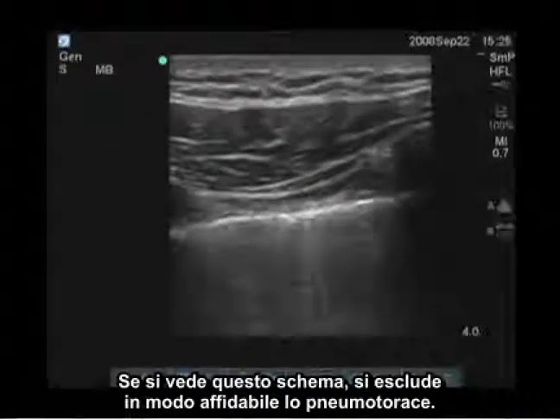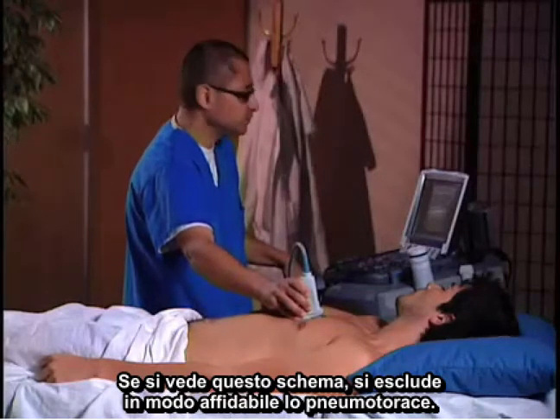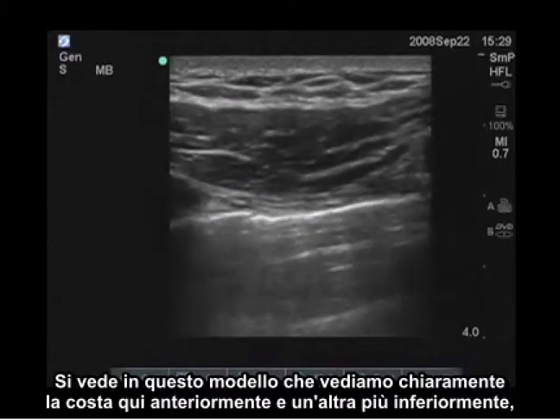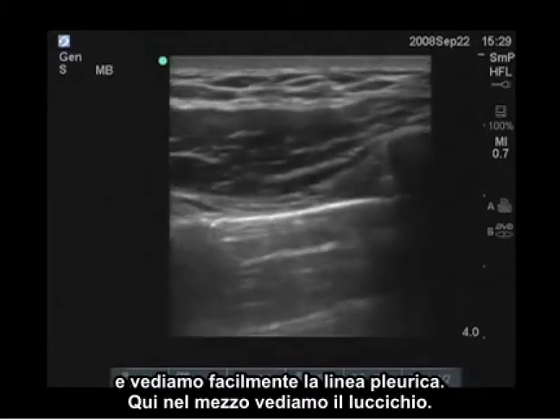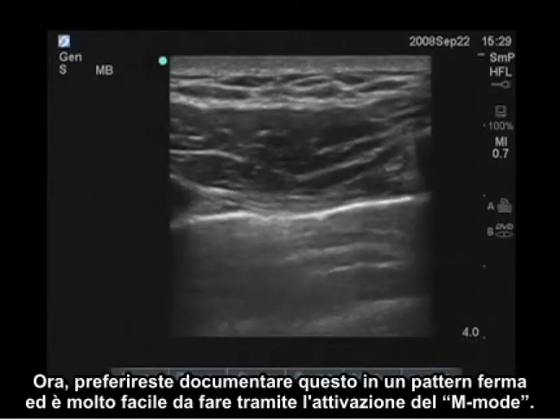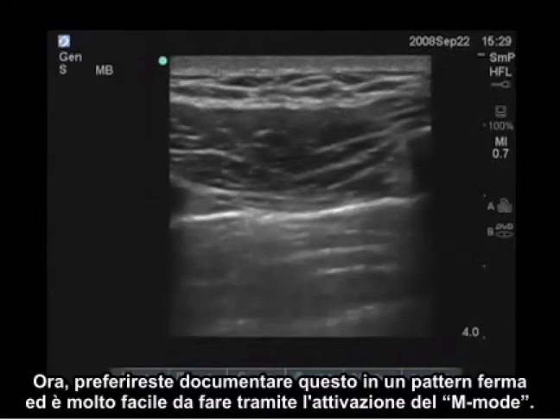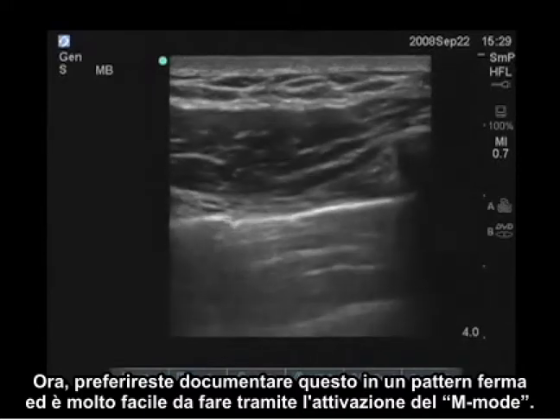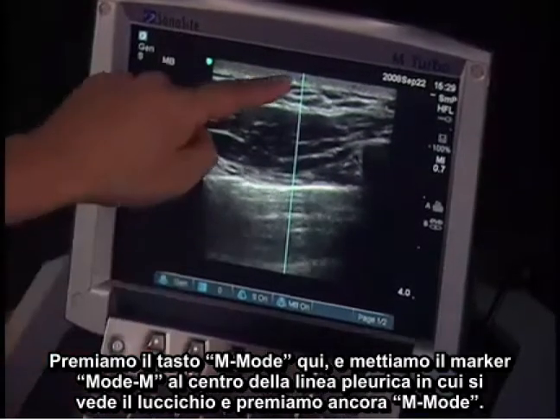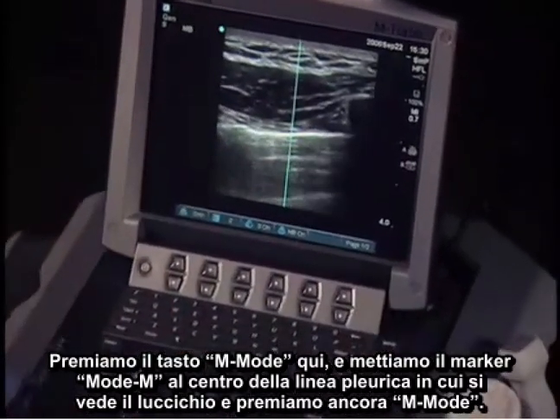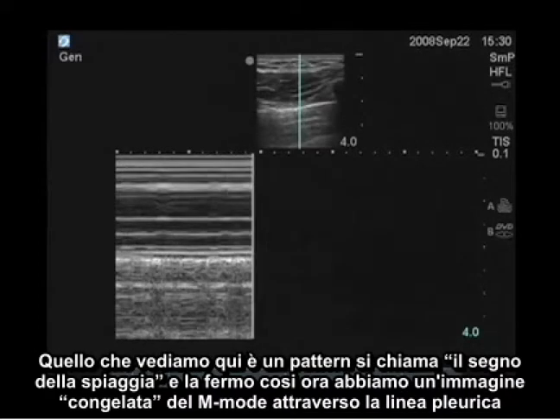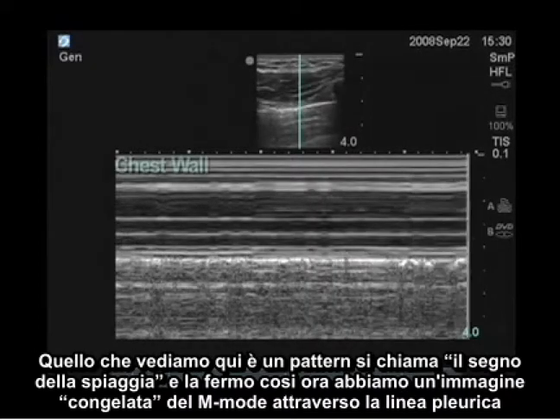If you see this pattern, you have reliably excluded a pneumothorax. You can see in this model the rib anteriorly, another one more inferiorly, and the pleural line easily in the middle with shimmering. Now you may want to document this in a still pattern, which is very easy to do by activating M-Mode. We hit the M-Mode key, put the M-Mode marker through the center of the pleural line where we see shimmering, and hit M-Mode again.